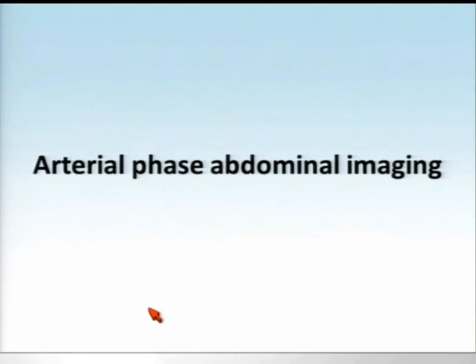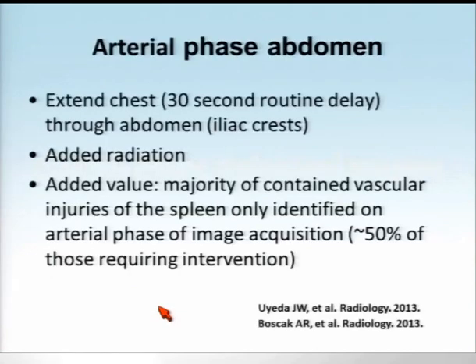Let's move on and discuss for a few moments the application of arterial phase abdominal imaging in the trauma population.